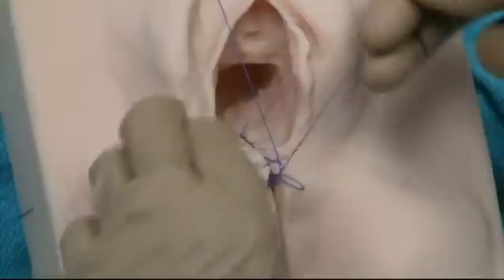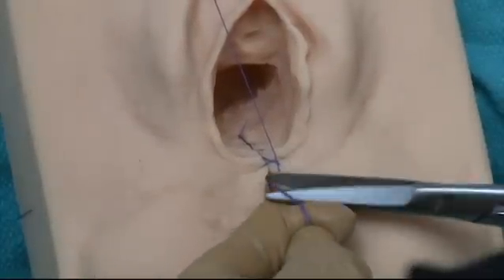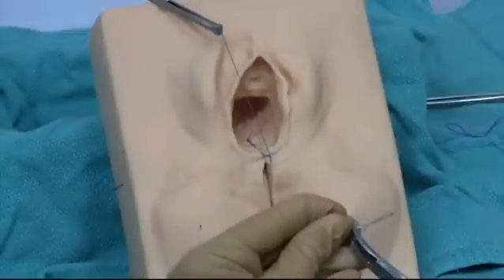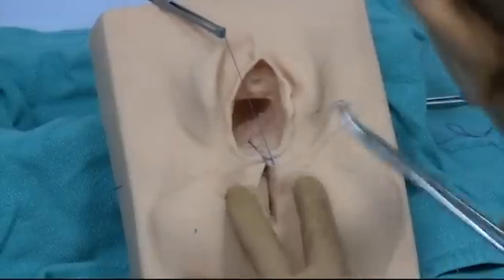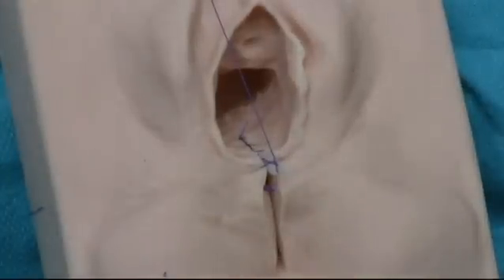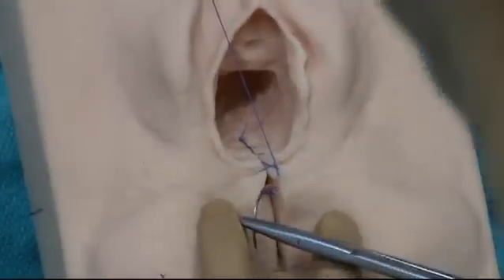Now if you have any more dead space you need to bring that close together, so you may need to do another simple stitch that's deep in the perineum — this one does not need it. That's because if you don't close the deep space you can have more bleeding into it and then you'll get a hematoma.